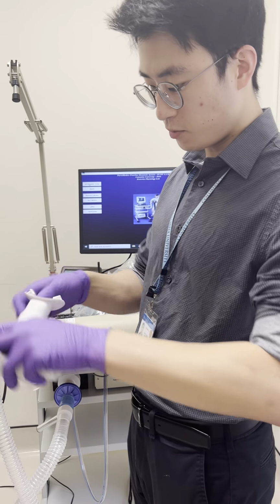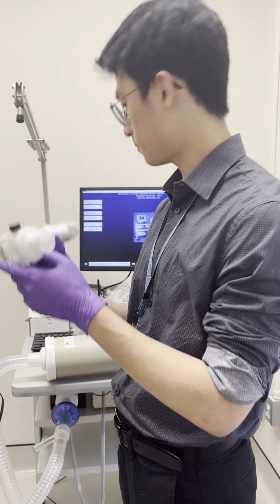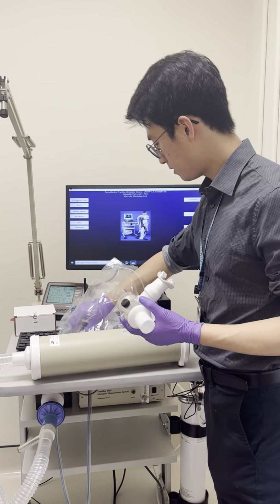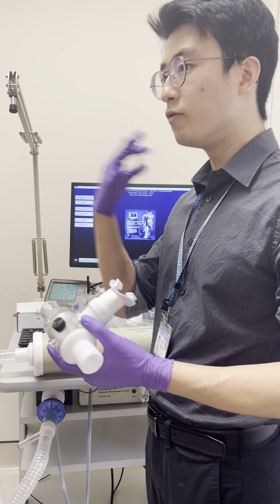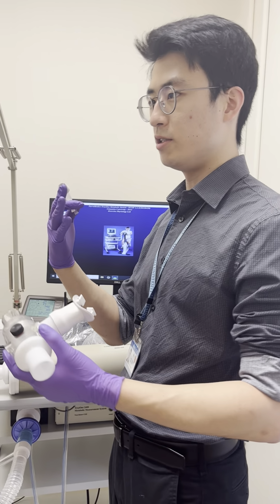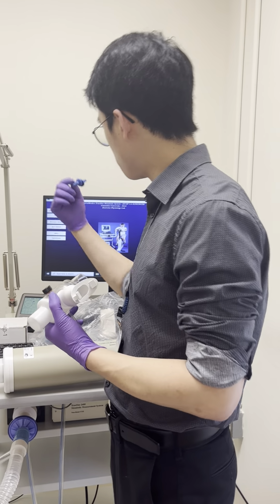So when you put it on, just make sure that it's horizontal level with the patient's mouth. And the last thing you're going to need is a nose clip. This is basically to ensure that all of the breathing goes into the machine, and you're not breathing through your nose. These are the ones that come with the machine.